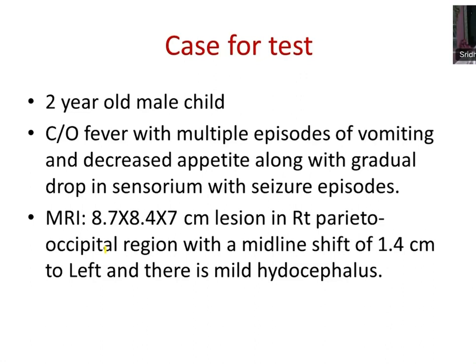Now, if that is over, maybe you can take the test, how much is there. So who is going to volunteer for this case? Maybe Kumudini, yeah, want to take it, take it.